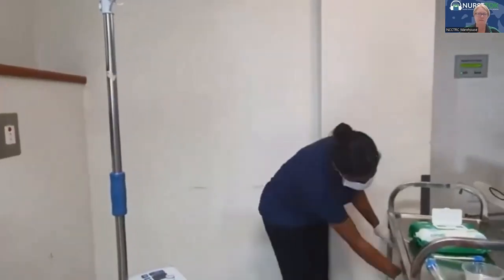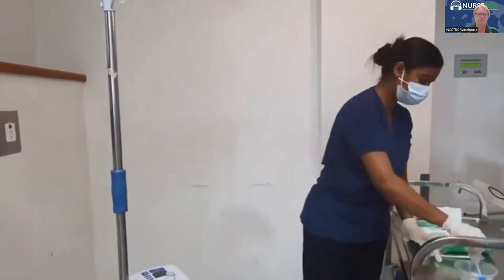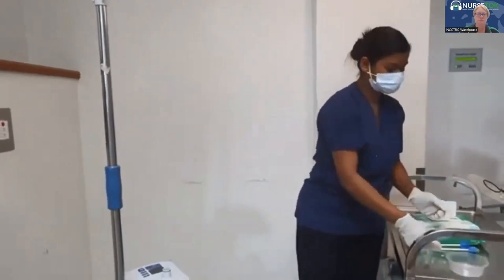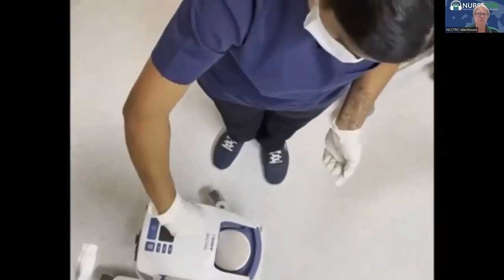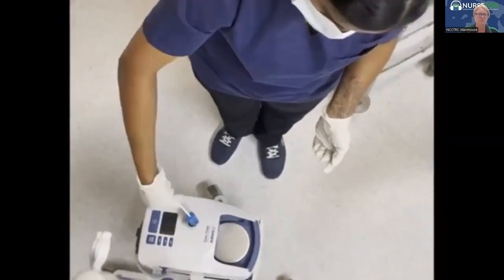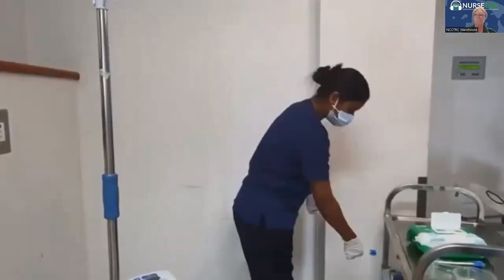Once you remove all the circuits, clean the outlet elbow on the right. Dip the sponge stick into the mixture of warm water with approved mild detergent solution. Thoroughly clean the outlet elbow from both ends using a sponge stick. Rotate the sponge stick while cleaning. You can always discard.